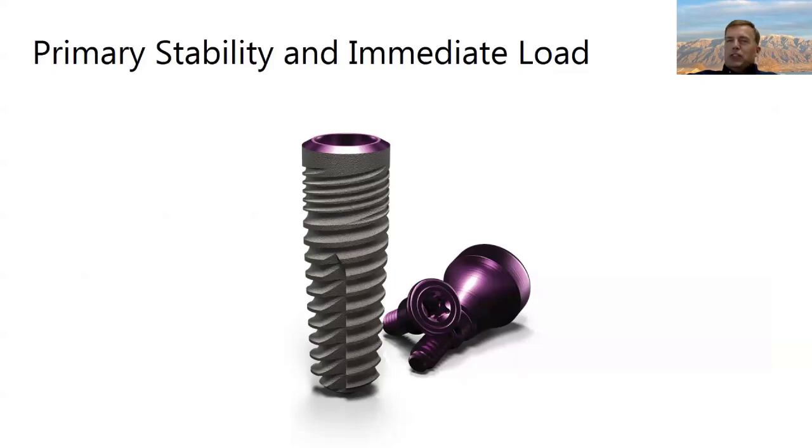Most of our all-on-X patients have seen the commercials and they're like, I want teeth in a day. I want teeth in a day. Let's make sure I get teeth in a day. So primary stability, immediate load is going to be really important.